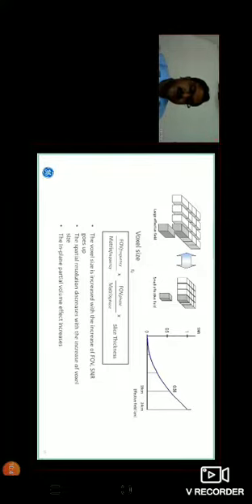FOV in the frequency direction divided by the frequency matrix, the FOV in the phase direction divided by the phase matrix, and the slice thickness gives you the voxel size. No need to worry about this mathematics. Actually, in the scan parameters on the scanner, you can see the pixel size directly.